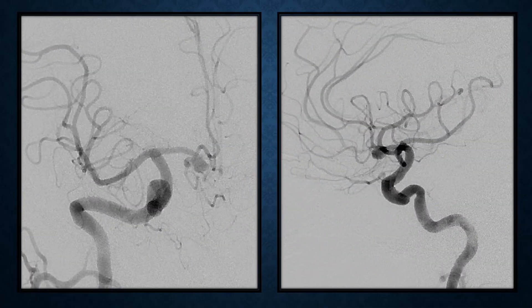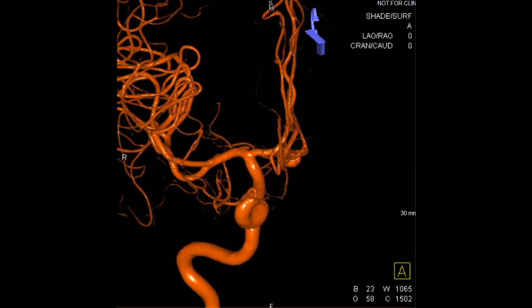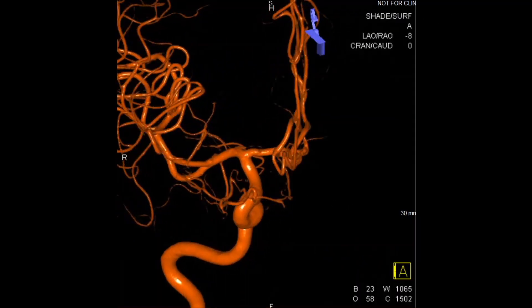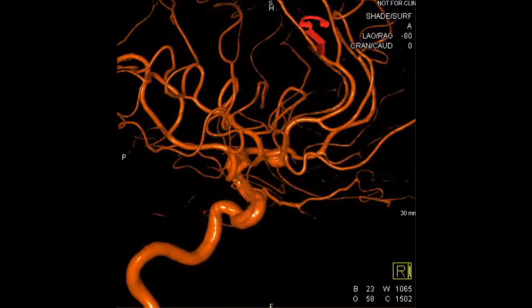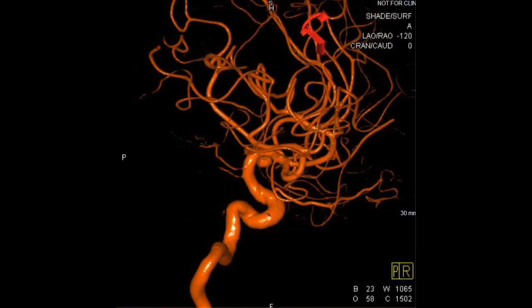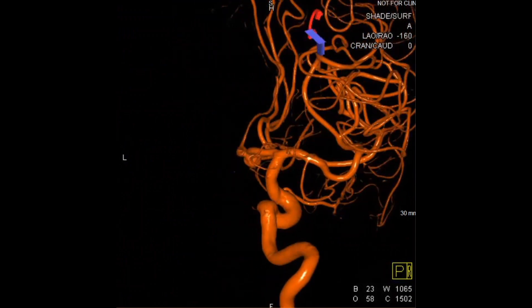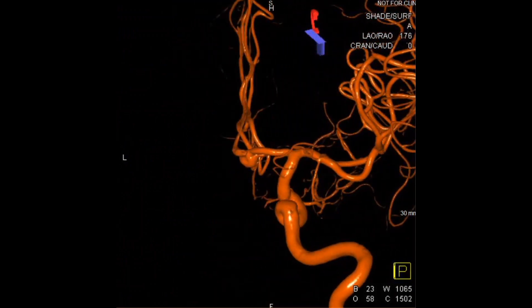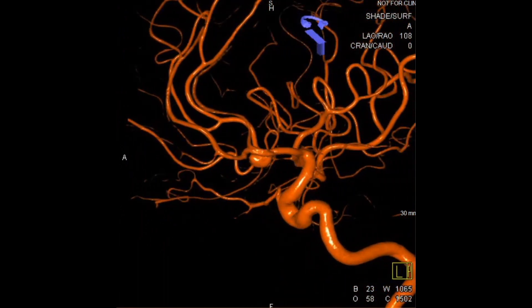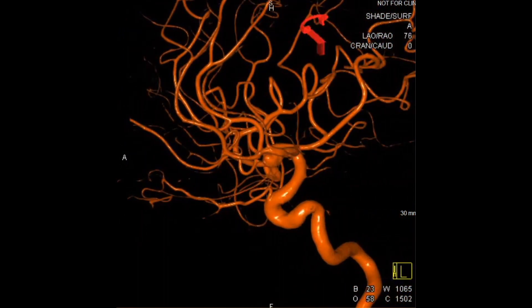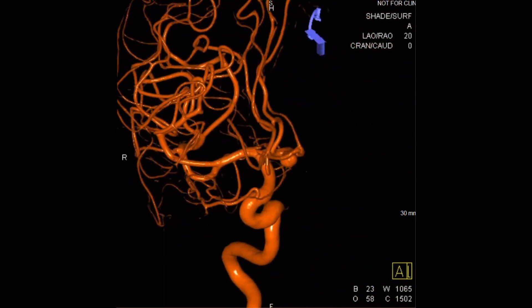Her diagnostic cerebral angiogram is shown in AP and lateral views. 3D angiography demonstrates the cerebral aneurysm well, measuring 5.5 by 3 millimeters with a 3.9 millimeter neck. The aneurysm projects anteriorly.